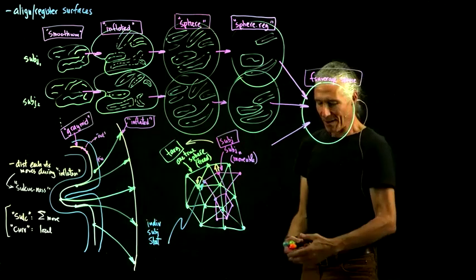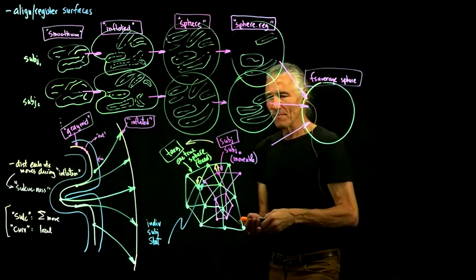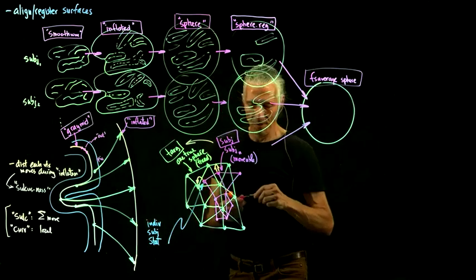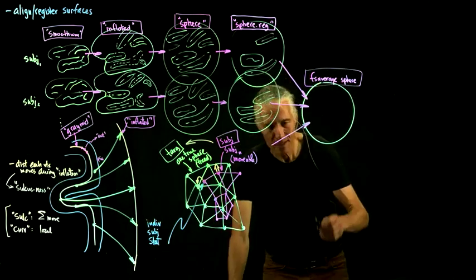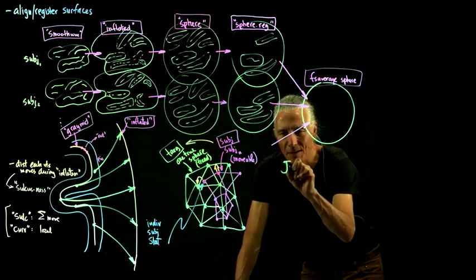So how do you do this? It's not very hard. It's very similar to what we were talking about before, and so we have to define an error, like an error function. So here's another error function. We'll call this one the sulc error.